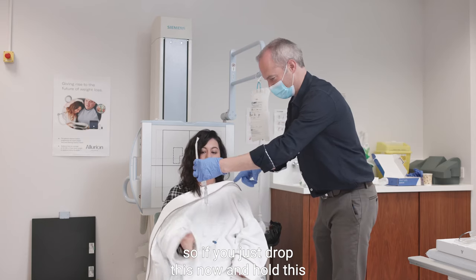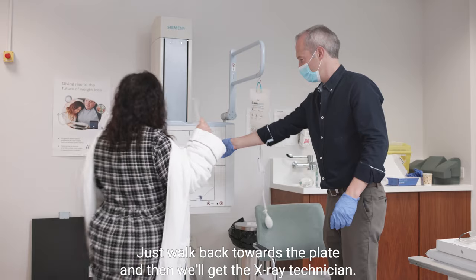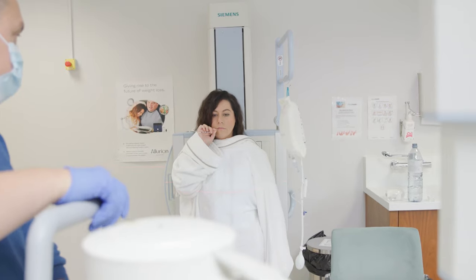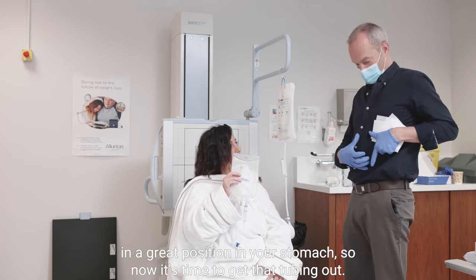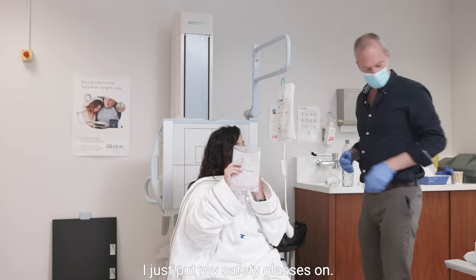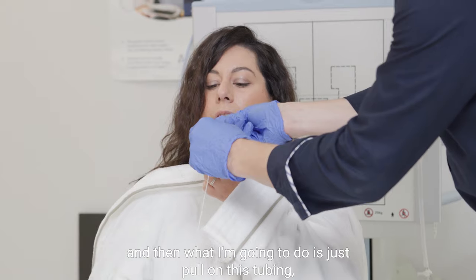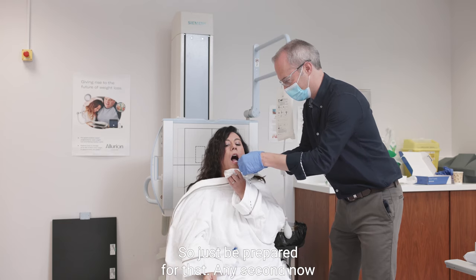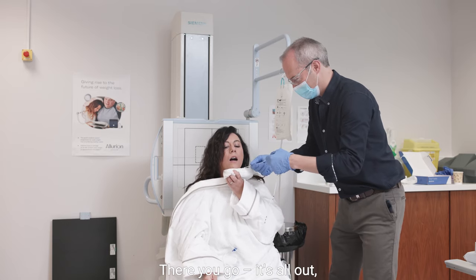So Georgie, if you just drop this now and hold this, and if you stand up for your second x-ray, just walk back towards the plate and we'll get the x-ray technician. We've confirmed that the balloon is in a great position in your stomach. So now it's time to get that tubing out. If you hold this under your chin — I'll just put my safety glasses on — look forward and I'm going to pull on this tubing, so open your mouth. Your head is going to recoil back as it snaps off, so just be prepared for that. There you go — it's all out, it's all done.